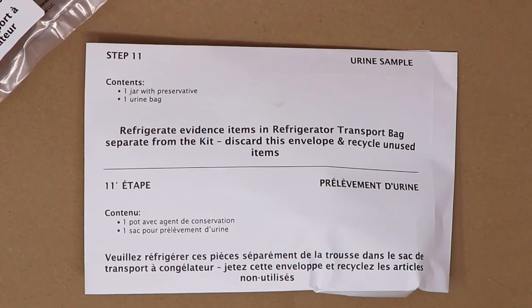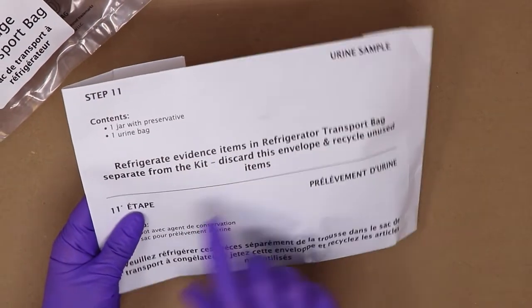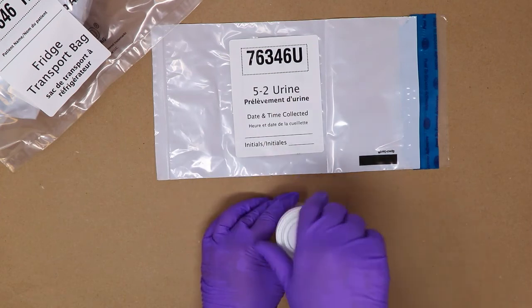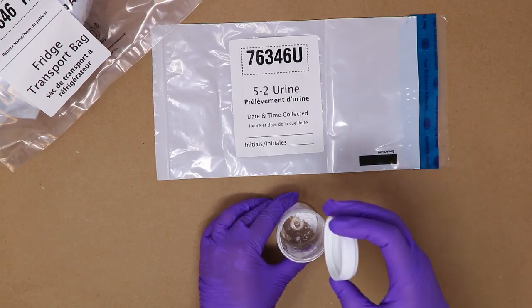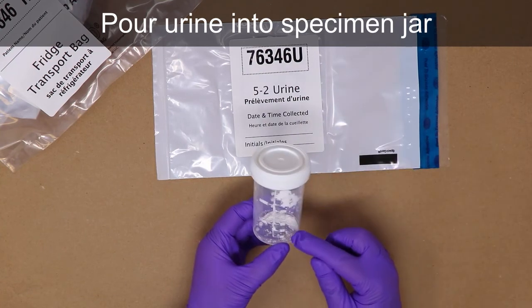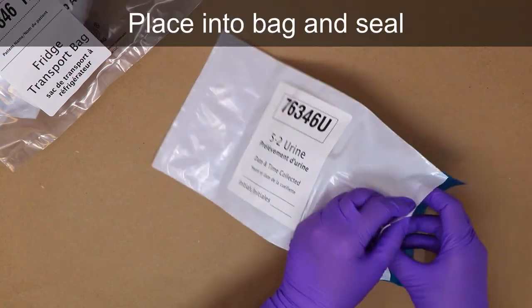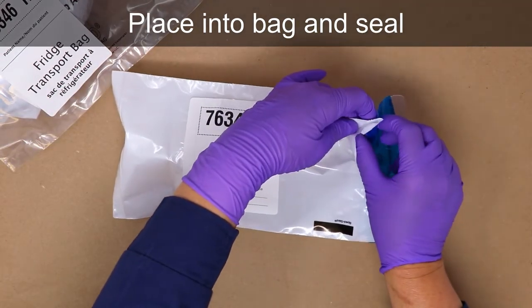The Step 11 envelope includes a jar with preservative as well as a urine bag. Note that the urine should initially be collected into a separate sterile specimen jar. Pour at least 20 ml of urine into the jar provided with white powdered preservative. The closed jar may then be placed into the urine bag 5-2 and the bag sealed.